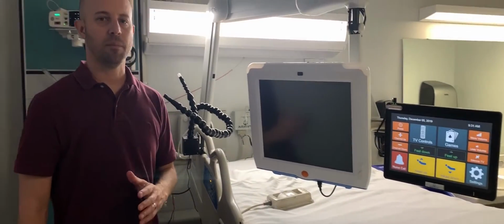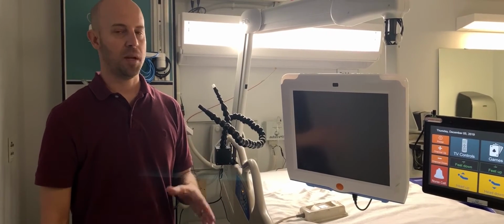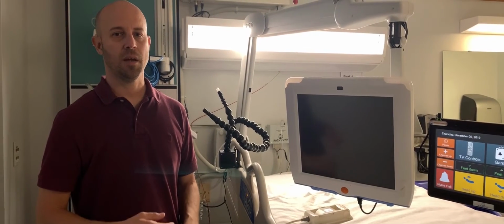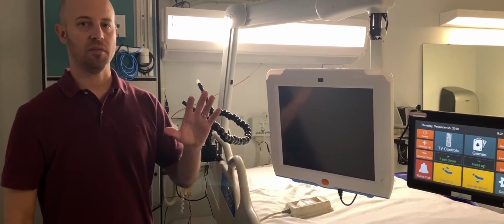For some patients, this will work right away, but for many patients, you will need to do a microphone configuration and possibly voice training to improve the accuracy of each button.